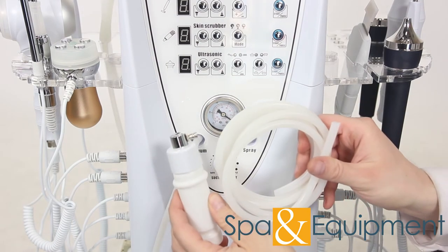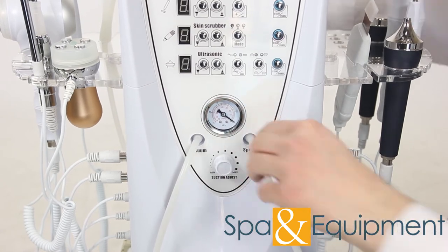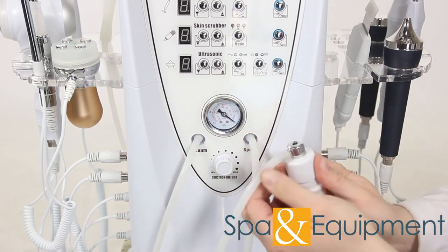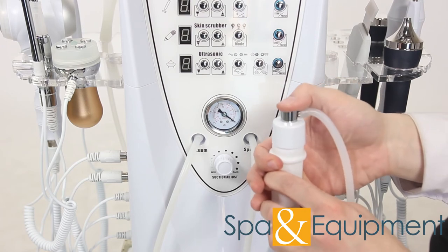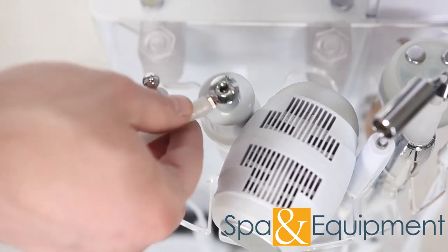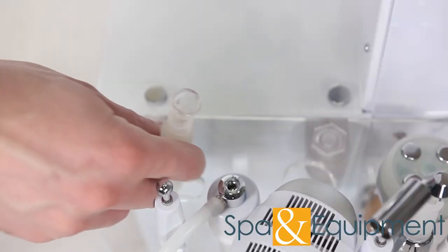Next we will attach the spray hose and bottle. Attach the hose to the unit, and then connect the other end to the spray bottle. Please note that the hole on top needs to be covered in order for water to spray out. You can find a spot for the spray bottle and vacuum handle next to the hot-cold hammer.